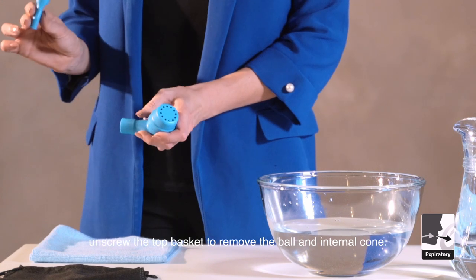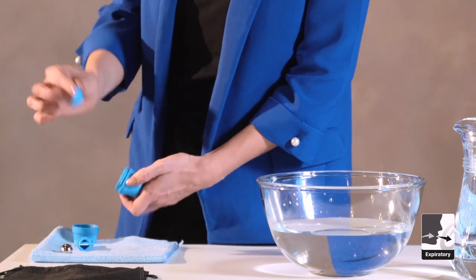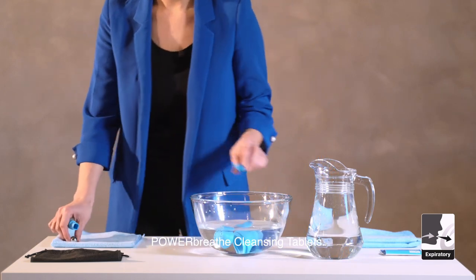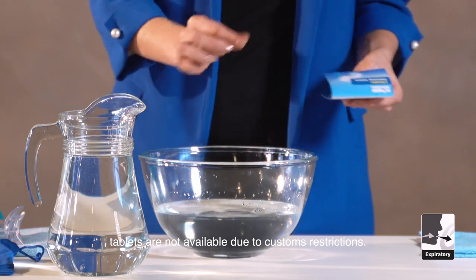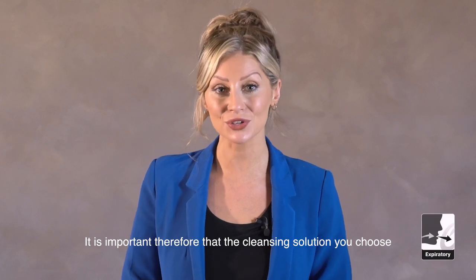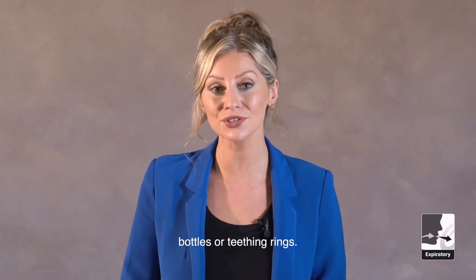Once a week, remove the mouthpiece and unscrew the top basket to remove the ball and internal cone. Soak the parts in a mild cleansing solution using PowerBreathe cleansing tablets. If you are based in the USA, however, our cleansing tablets are not available due to customs restrictions. It is important therefore that the cleansing solution you choose must be intended for use on equipment that comes into contact with the mouth, such as that used for baby bottles or teething rings.